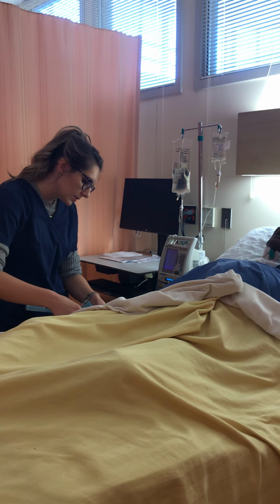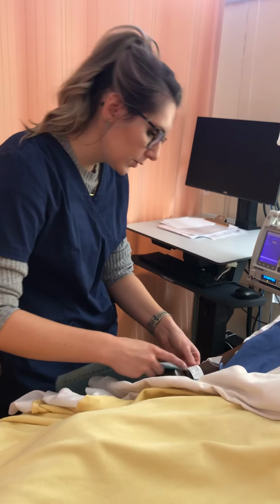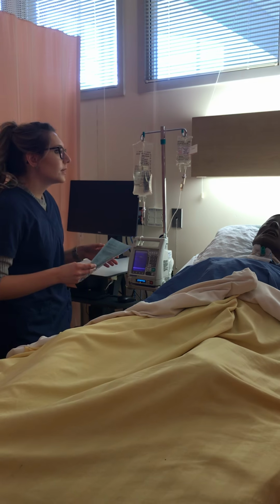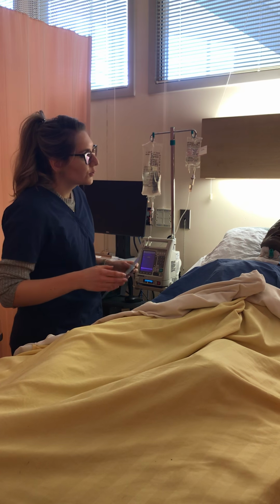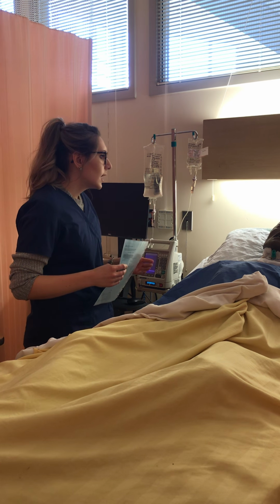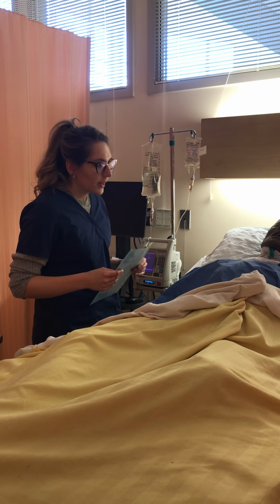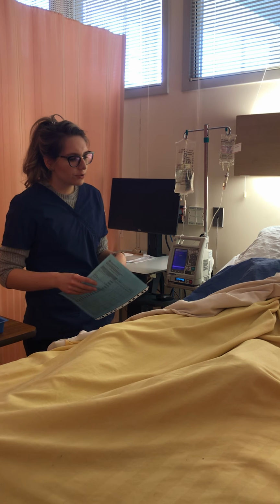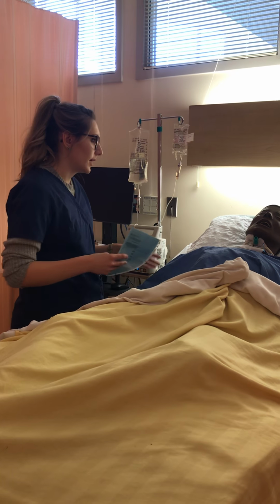Scotland, Bryson, bin number 1, 2, 3, 4, 5, 6, 7, 8, and their birthday, 24 years old. Can you state your name and birthday and any allergies for me? Okay, so today we're going to be doing your insulin continuous infusion. That's because of your uncontrolled high blood glucose levels. We're going to be monitoring your glucose levels throughout this, just to ensure that your blood glucose is in the doctor's ordered range. They have the ability to decline at this time if they so choose. I'm also going to be changing your chest tube dressing because of your pneumothorax from your accident.